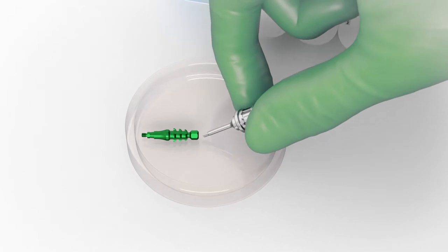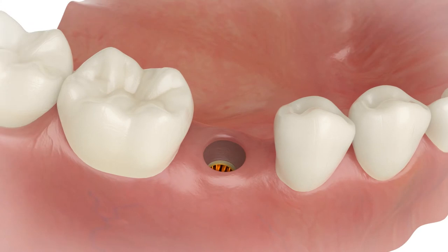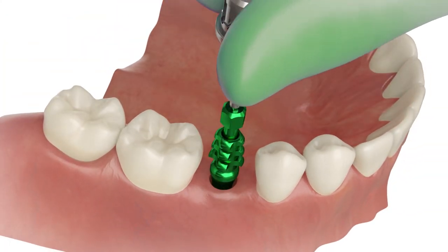Place the screwdriver to the transfer's hex and manually insert it into the implant.